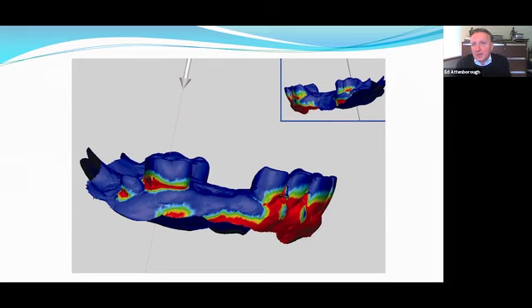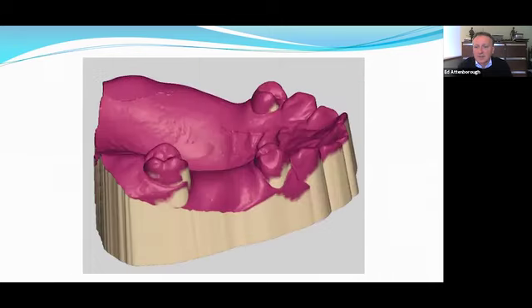Now, normally that would be done on a surveyor in the traditional classic process, and it's a very similar process and workflow digitally, and you can see the undercuts that are represented. Once you're happy with the path of insertion, and that is quite a fiddly process, it's not something that lends itself to a touchscreen. That's the kind of thing you want a keyboard and mouse to do.